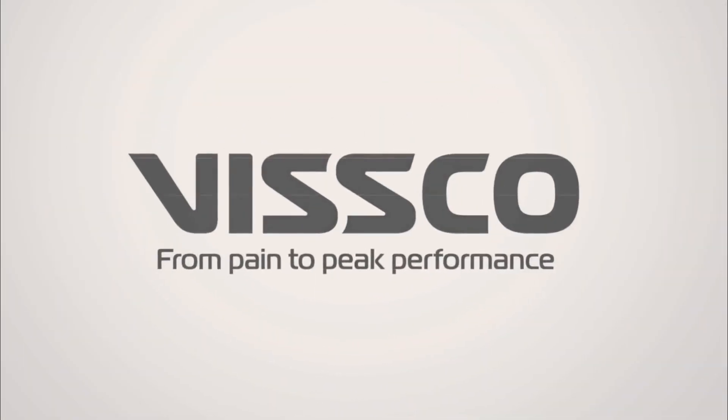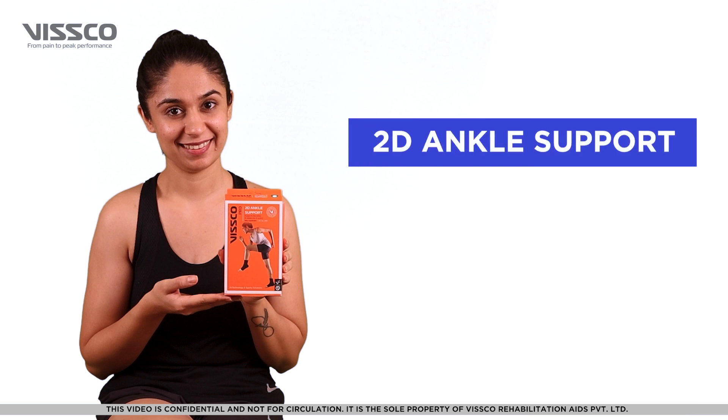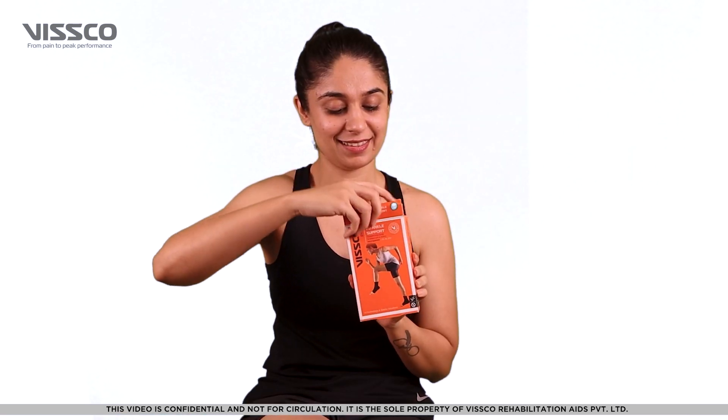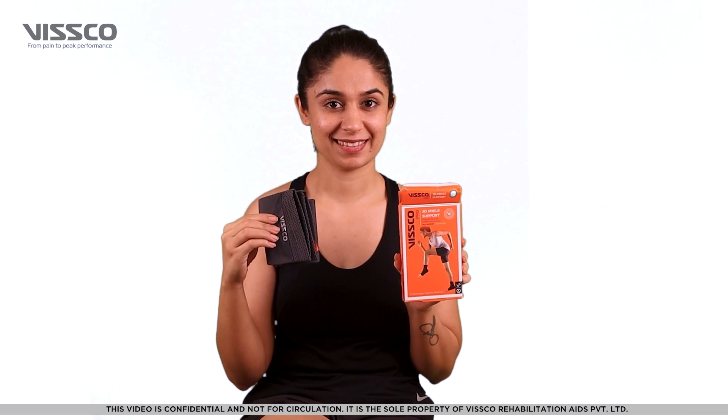Hi there, greetings from Vissco. Let us now see how to wear the Vissco 2D Ankle Support, Product Code 2707. The Vissco 2D Ankle Support provides support to the ankle and keeps you in action.